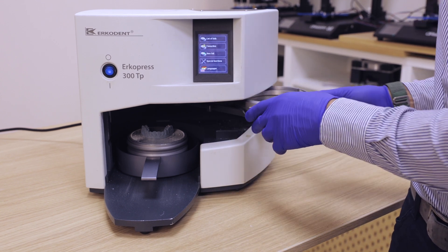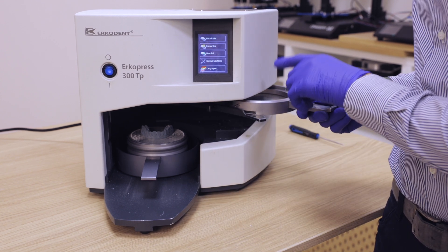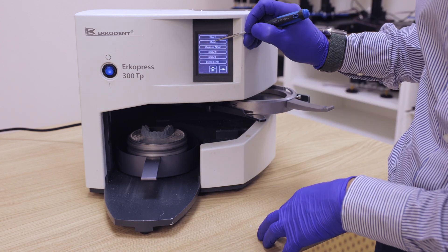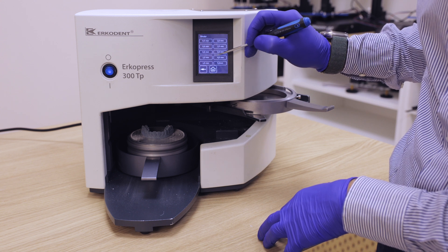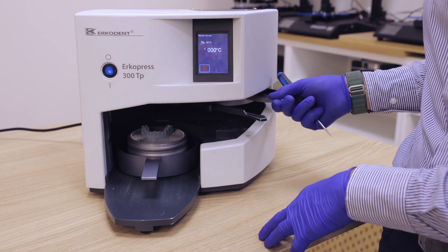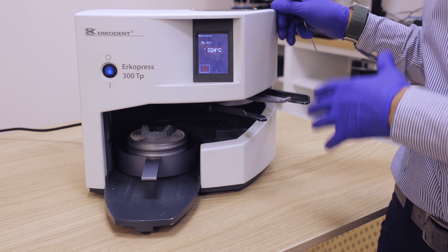Now we put the sheet to heat. We select our material and then we start heating the sheet.